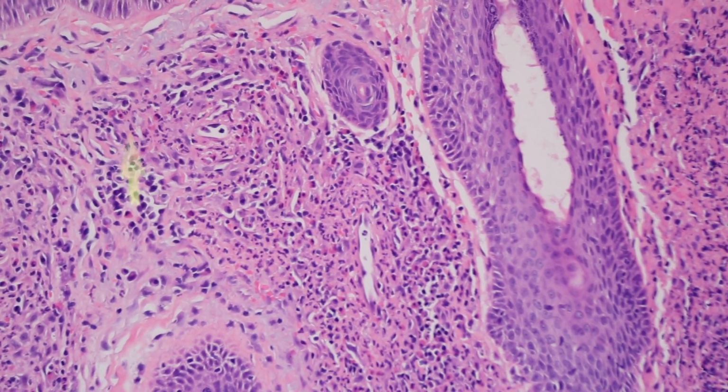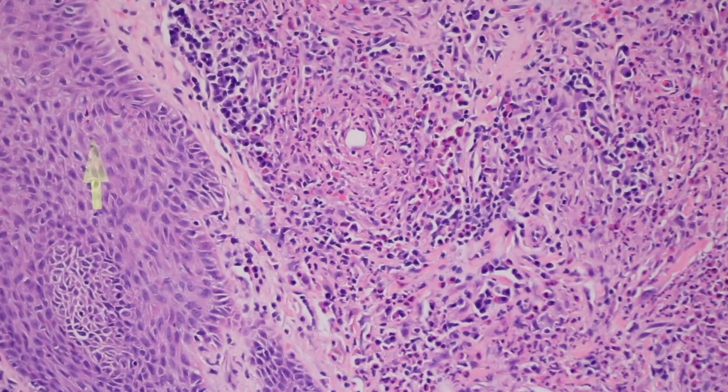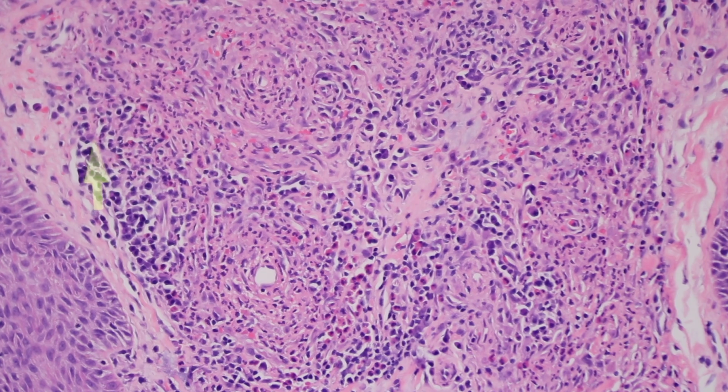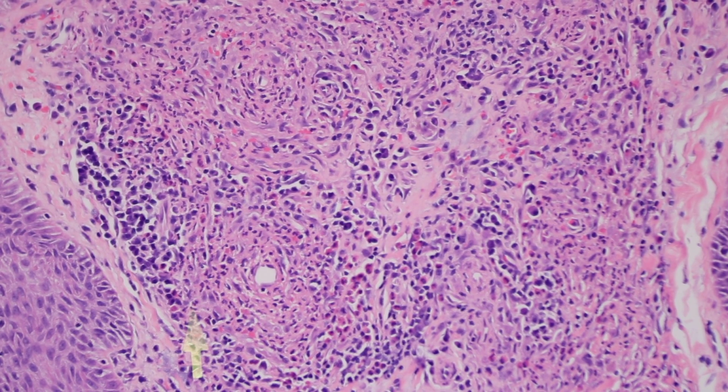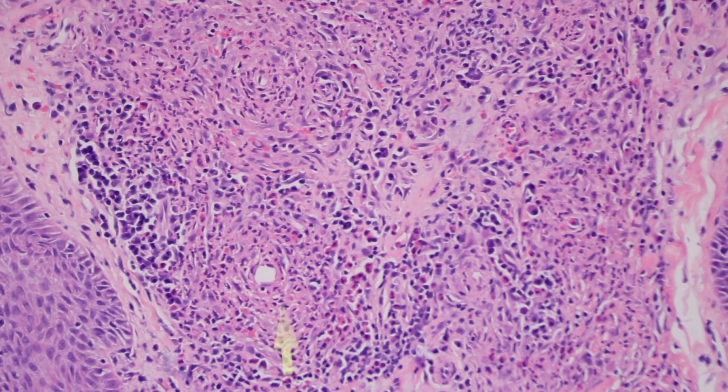See how there's kind of a spiral of swirly deposition of not only fibrin but also a little bit of collagen and some spindle cells that are starting to wrap the vessel in what people kind of say is an onion skin pattern. We use the term onion skin way too much in pathology, but it really does start to look like that. Here's another one. Here's a vessel that's got fibrin and neutrophils, and it's got this swirly wrapped pattern.